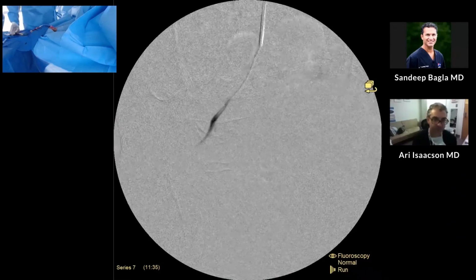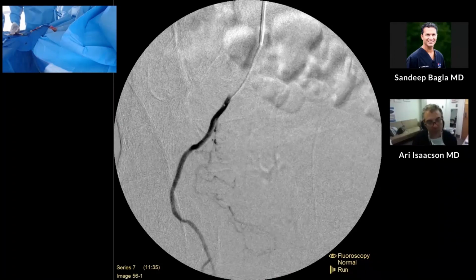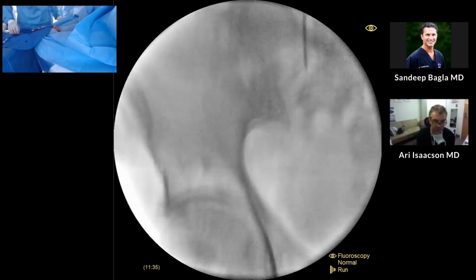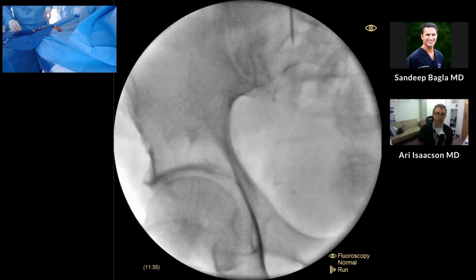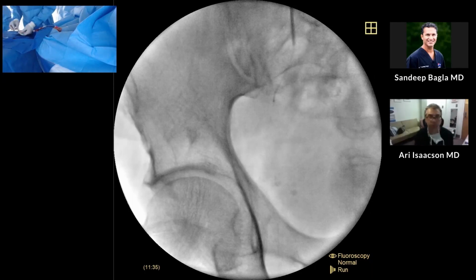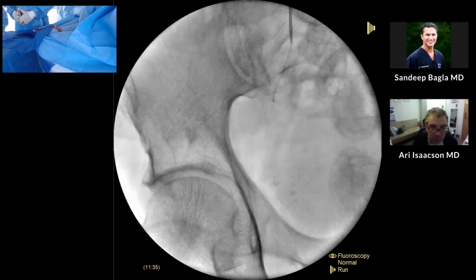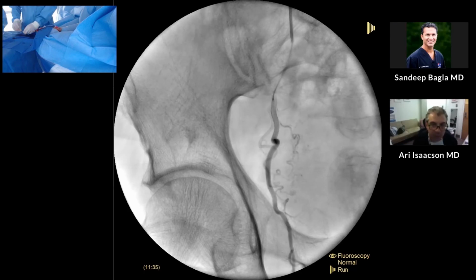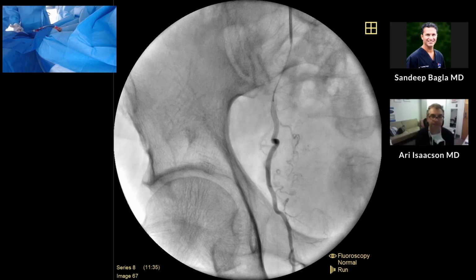And as you know, sometimes the pudendal, the angle of origin off the prostatic in an RAO or LAO may not be ideal. So what I'm going to do is switch a little bit here to an AP or sometimes a contralateral oblique, and I'll be able to see that origin even a little bit better. All right. And we'll do a run here, and there you'll see it. So now the prostatic goes off to the left side of the screen because, of course, you've taught me this trick. It's anterior. So there's the prostatic. So what we'll do is I'll just set this on tray.